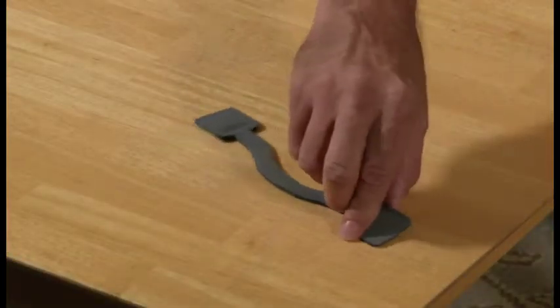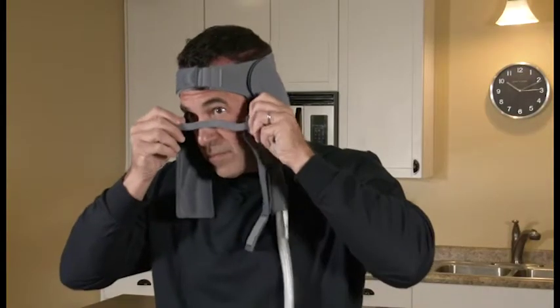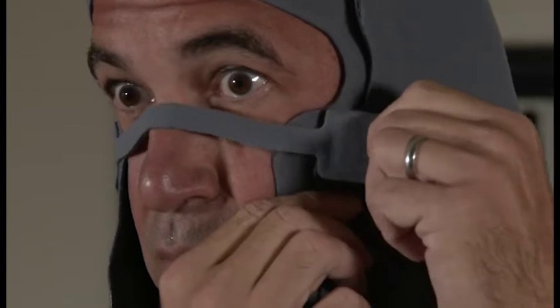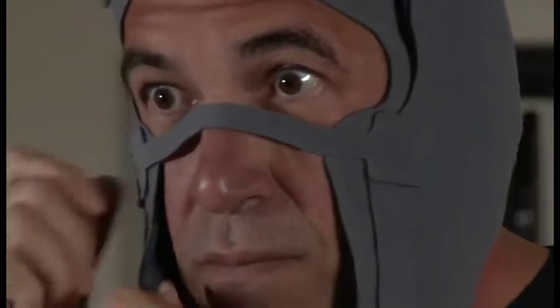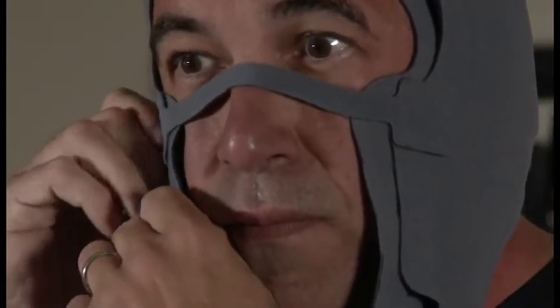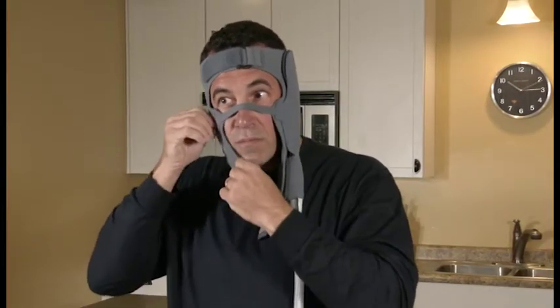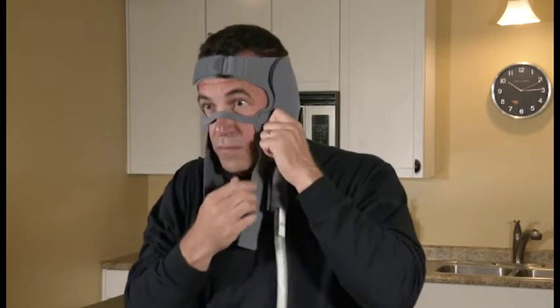Next, contour the nose piece across the bridge of the nose and secure the hook fasteners to the side of the head garment. When contouring the nose piece, make sure the garment makes good contact with your skin but that it doesn't cause discomfort to your nose. The head garment should never obstruct your vision or make contact with your eyes.